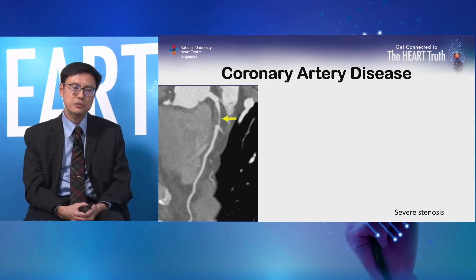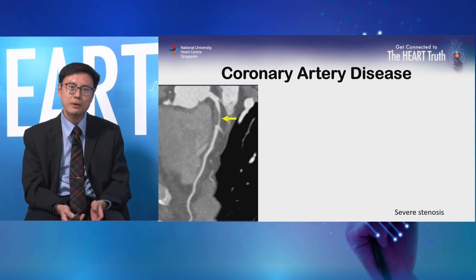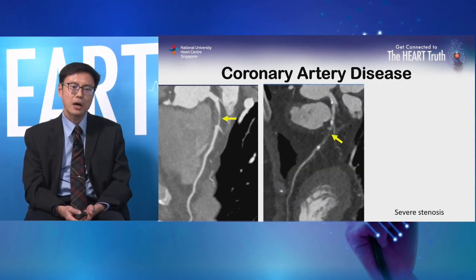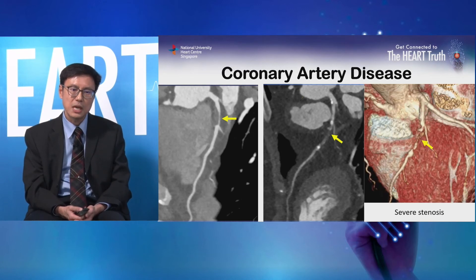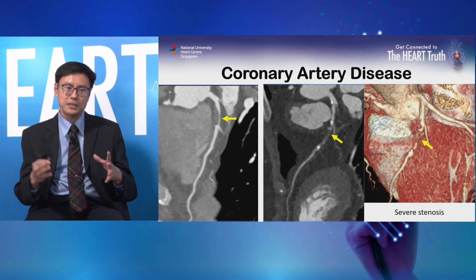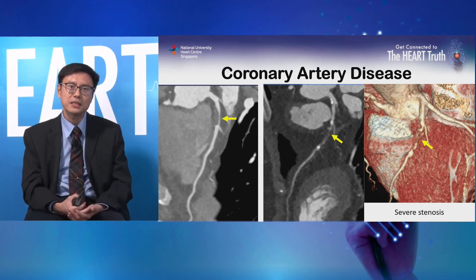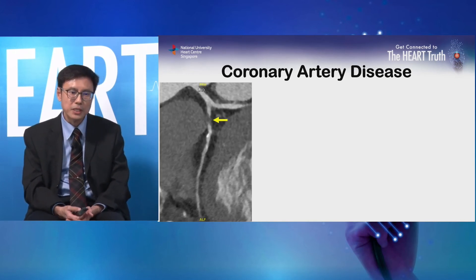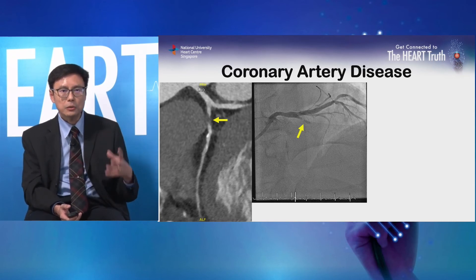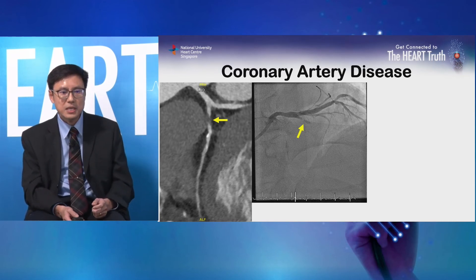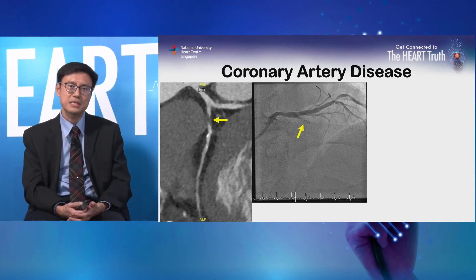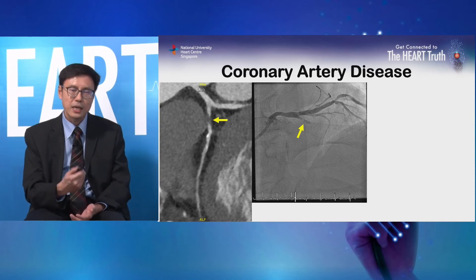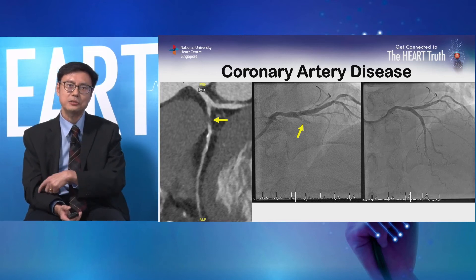These are examples of patients with more severe stenosis — you can see how narrow the segment of the artery is. We can also view stenosis from outside the heart using a three-dimensional volume rendered image, where you can see a very thin area where blood is just trickling through. Another patient's artery is almost occluded; he had chest pain and underwent invasive coronary angiogram, which confirmed the blockage. This patient underwent ballooning and stenting, and afterwards you can see blood flowing down the opened artery.